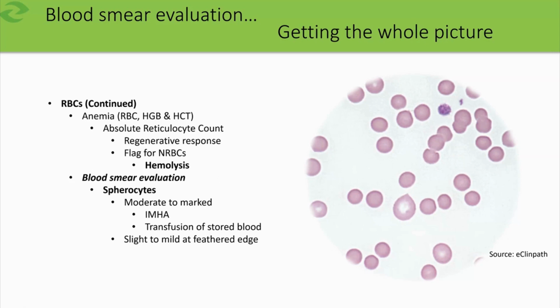From there, especially in dogs, you want to see that central pallor in the other cells, and to truly call it a spherocyte, it should be smaller and very round. So this one here could be a spherocyte, but it's being distorted by the red cell next to it. Same thing here. So I wouldn't call those spherocytes. They may be, but I'd feel comfortable certainly calling these smaller, perfectly round cells spherocytes.